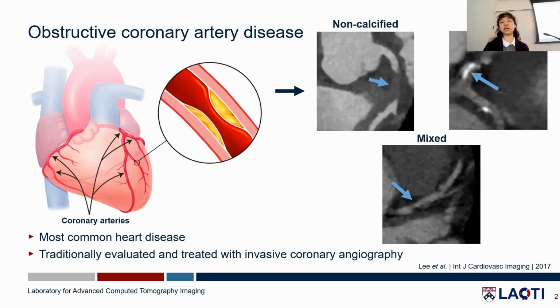And this plaque can be characterized via imaging techniques. Some of these include non-calcified, as marked by the blue arrow, calcified, and mixed. Traditionally, this is evaluated and treated with invasive coronary angiography. But over the years, this has transitioned to CT evaluation.